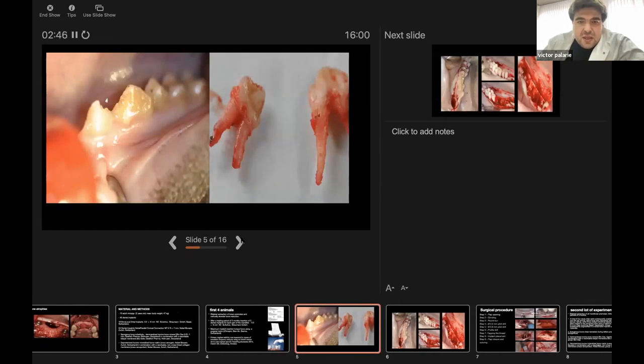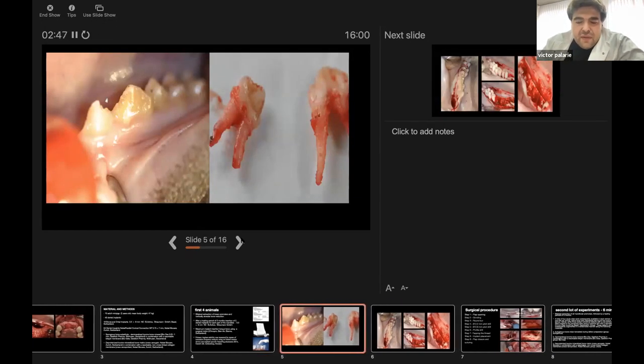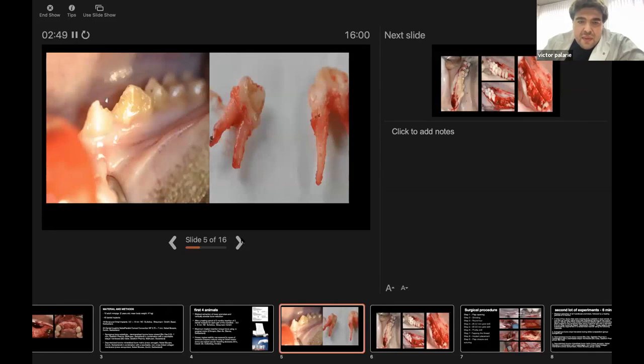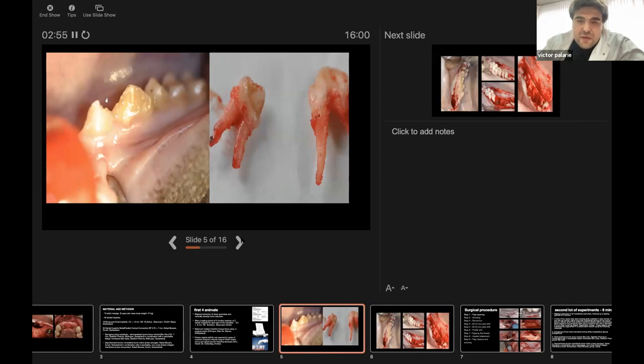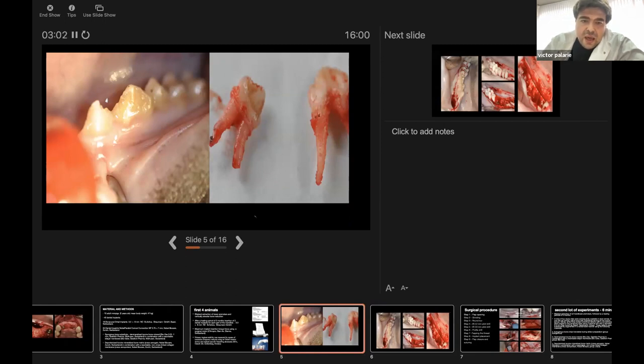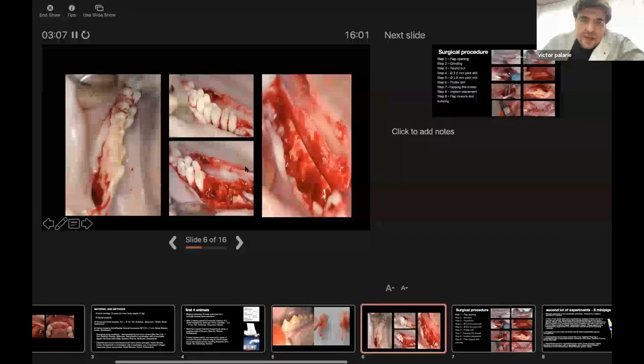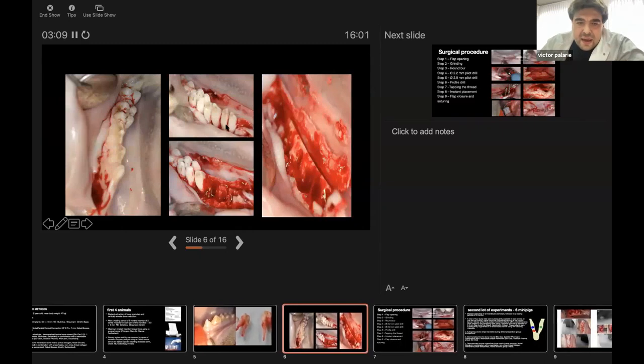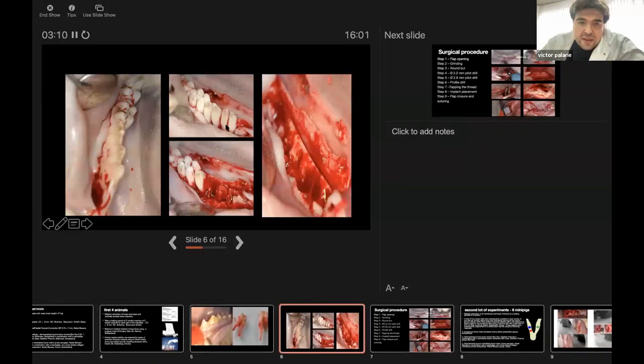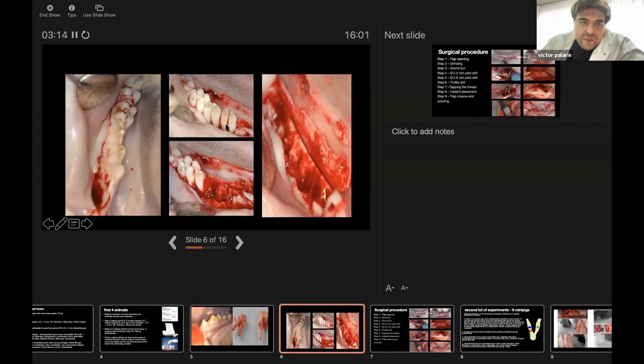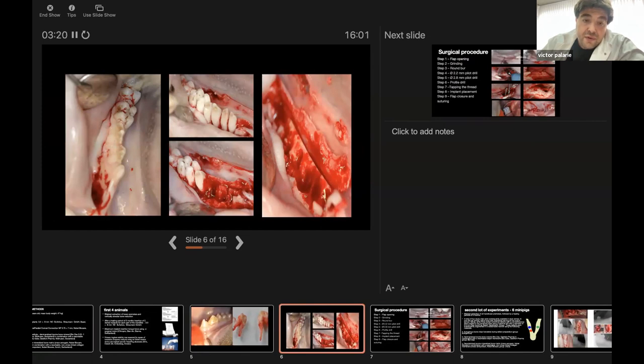Special attention was given to the extraction of the teeth in mini-pigs because of the morphology. The anatomical particulars of these roots are much thinner than in humans and they can have different curvatures. To avoid complications like apex fracture, we decided to cut the crowns in two parts and extract each root separately. In comparison to humans, premolars in this case have two roots, and in humans we have just one root.